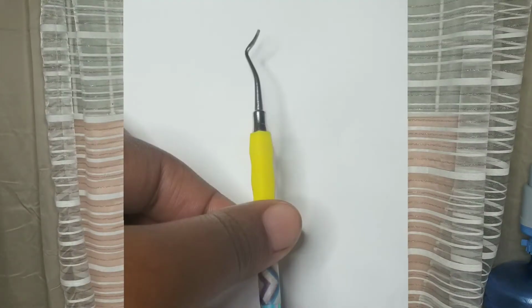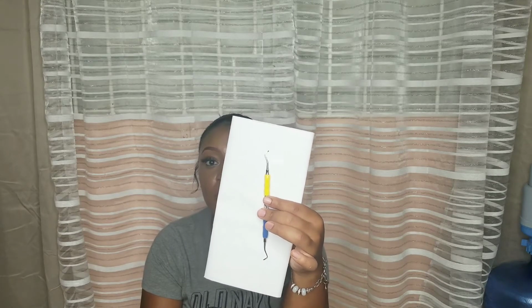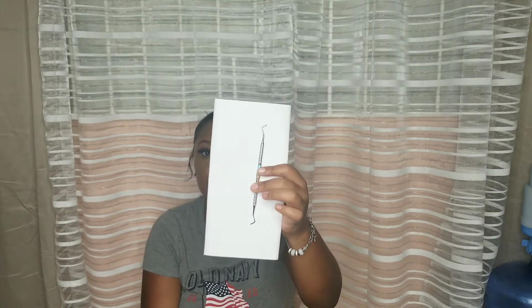Some other instruments that you're definitely going to need, these are hand instruments now that I'll be talking to you guys about. This one is a Gingival Marginal Trimmer. As I said, guys, these won't make any sense to you right now, but it's an instrument that you'll need and you will learn how to use them. So this is a Gingival Marginal Trimmer. You're definitely going to need a hatchet, which looks like this. I'm probably going to have to take pictures of these and insert them on the screen, but you need a hatchet.